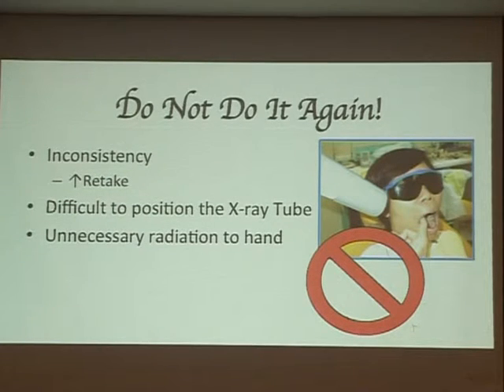Okay, you know why? Patient always asks, why does everybody go away, right? I will say to the patients, you only have 1 X-ray today. I have 20 patients a day. Okay, so I have to go on. So I do not recommend you do this because it will increase the retakes. Because it's not a good X-ray, sometimes it's difficult to position the X-ray tubes, and it's unnecessary for patients' hands.